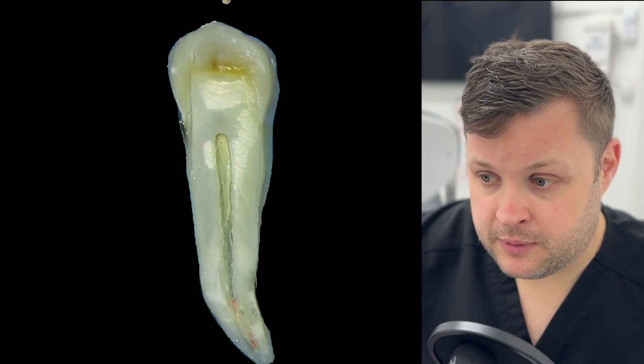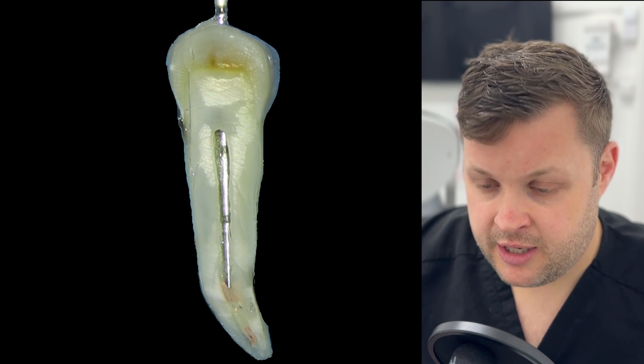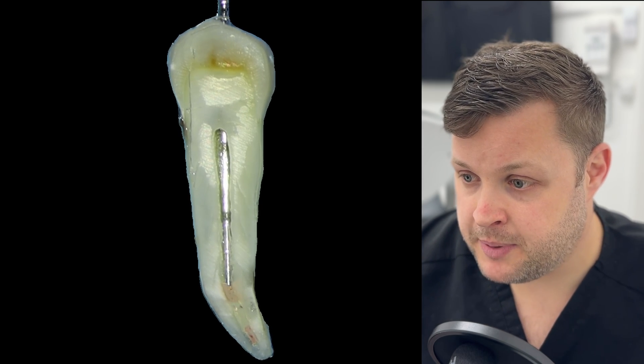Some people like to backfill their GP from top to bottom — I am not so brave. I like to place a little bit of warm GP and then condense it down with my Machtou plugger. I do this when I can't quite see the end of the GP plug. Once I've placed a few layers of warm GP, I get closer to the end of the root canal.